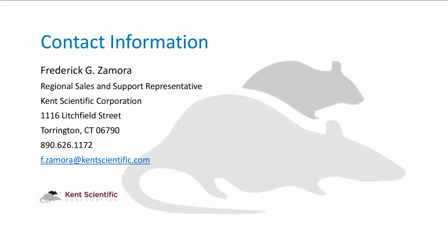All right, next question here is, if you're using the multiple animal setup, let's say 3, what flow rate would be recommended as the setting? If one is set as low flow to be more of a maintenance rate, and one is set as high flow for induction, which should be best?